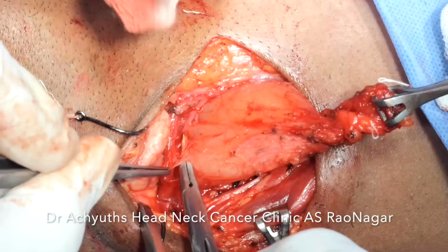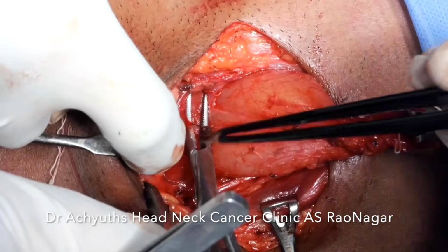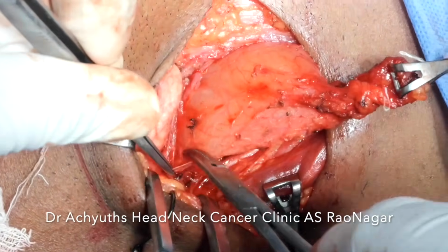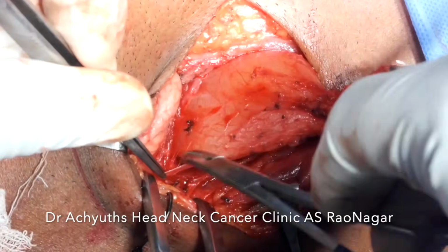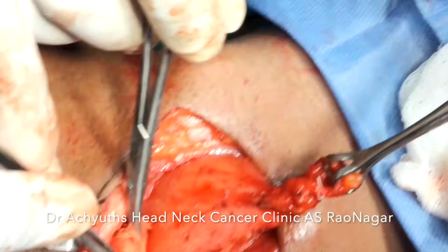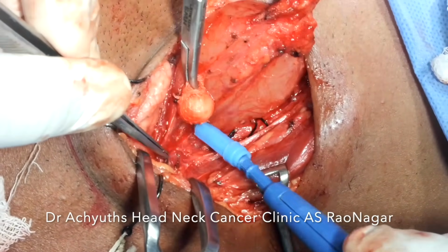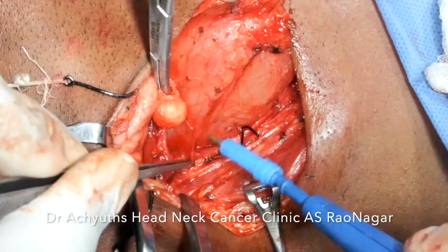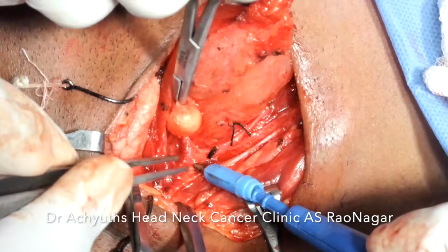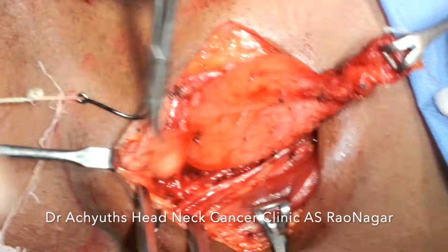Yeah, this is the division of the muscle fibers from the posterior belly of digastric. Again, this is a relatively boring kind of surgery because all that we do is divide the cyst wall, that's all.